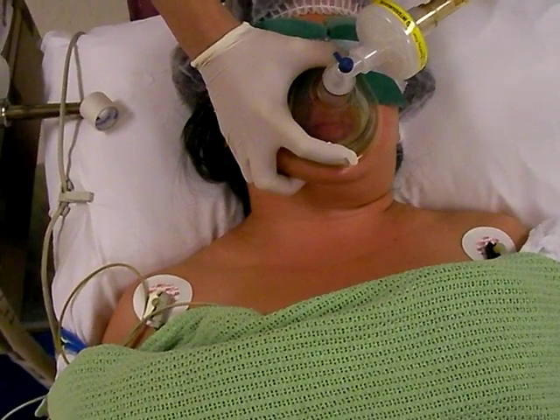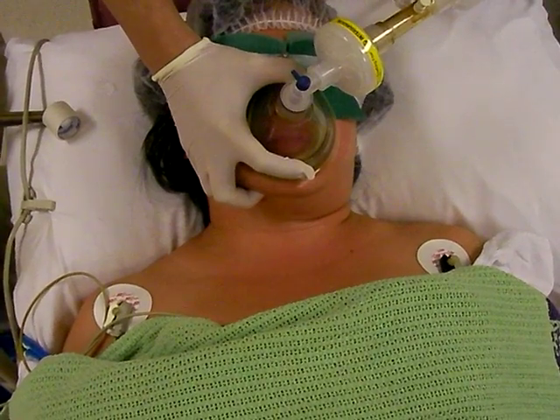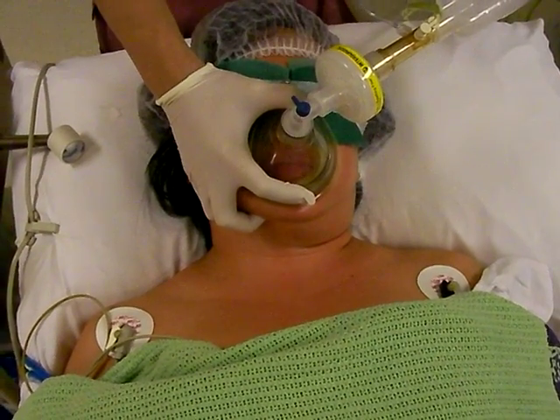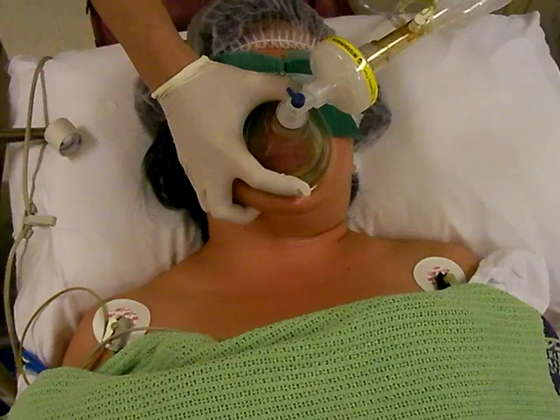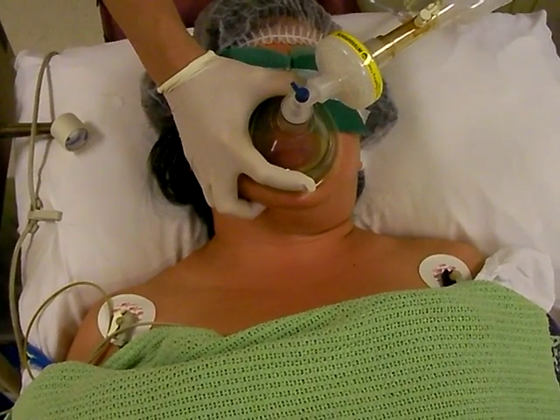I am going to demonstrate how to perform the oral tracheal traclight intubation. After putting the patient into sedation with full muscle relaxation, you put the patient into the usual intubation position.